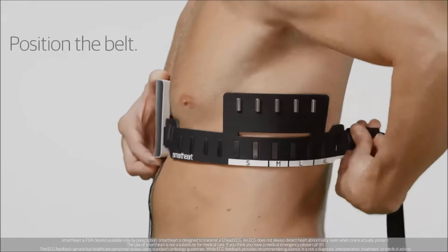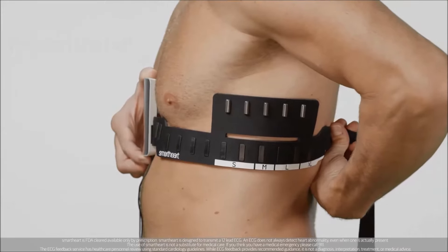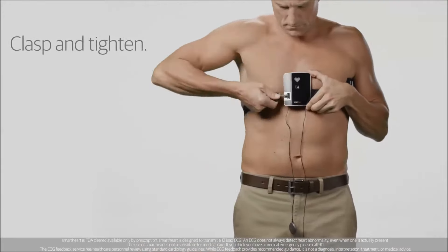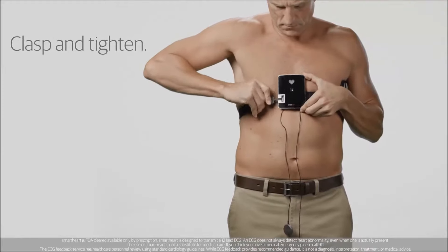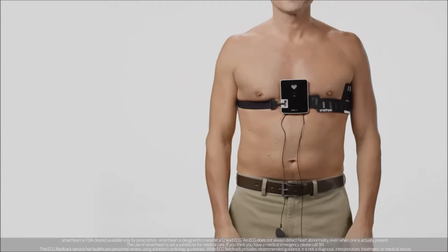Then position the belt, making sure that all the leads are in contact with the skin. Clasp the buckle and tighten the elastic band until it's tight enough to hold the SmartHeart device in place. You find the right size when the device is flat against your skin.